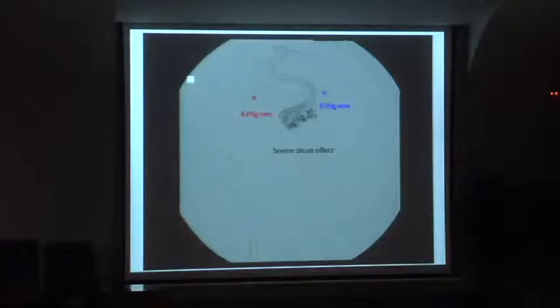Transarterial transvenous approach and pressure monitoring. It's very important, but the transvenous approach alone is very dangerous for a ruptured malformation. You can see one catheter placed transarterially in the malformation nidus, and the next in the superior sagittal sinus and draining vein. Pressure, arterial and venous, 67 mmHg.